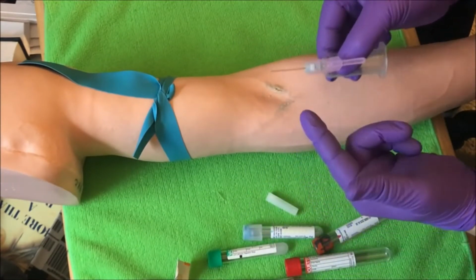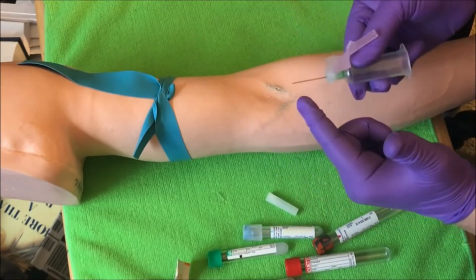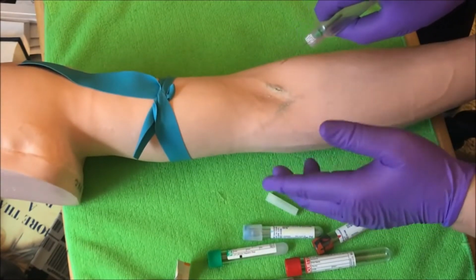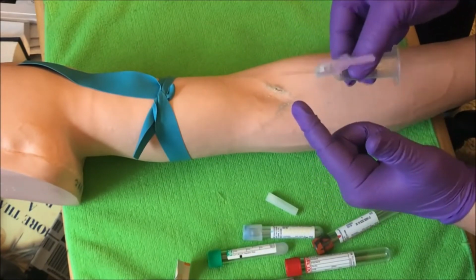If it's not, if the needle is sideways or upside down, I won't get blood half the time. The needle or the bevel can be against the vein of the wall, blocking the lumen. I could be upside down, again, blocking the lumen. I could be halfway in. I've got to know that the bevel is always up.